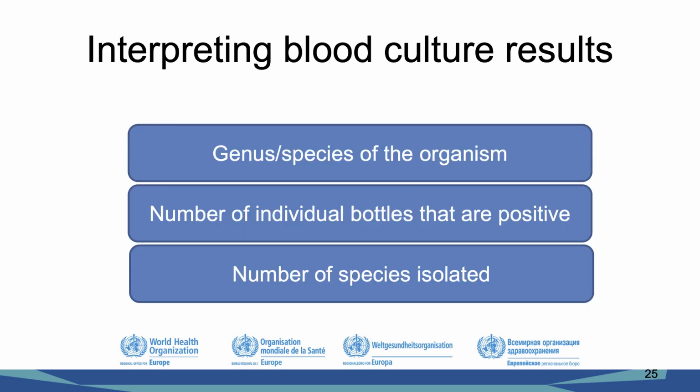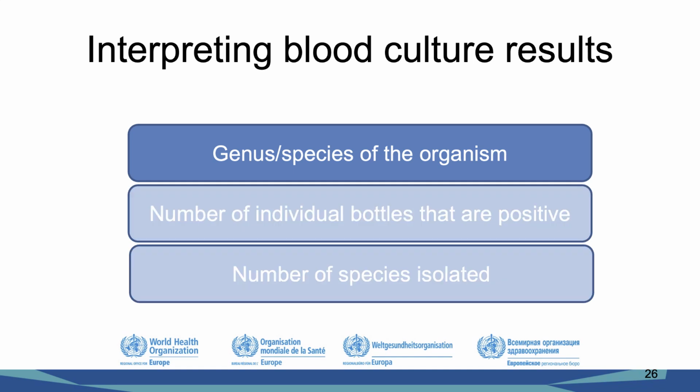When reviewing microbiologic data, clinicians can use the following to help distinguish a meaningful blood culture result from one that represents contamination. First, the genus and species of the organism can help. Some species, like E. coli, are very uncommon contaminants, while skin flora, such as coagulase-negative staphylococci, are more common contaminants of blood cultures. Although a common member of the skin flora, a positive blood culture for Staphylococcus aureus should not routinely be considered a contaminant given this organism's propensity to cause severe infection.